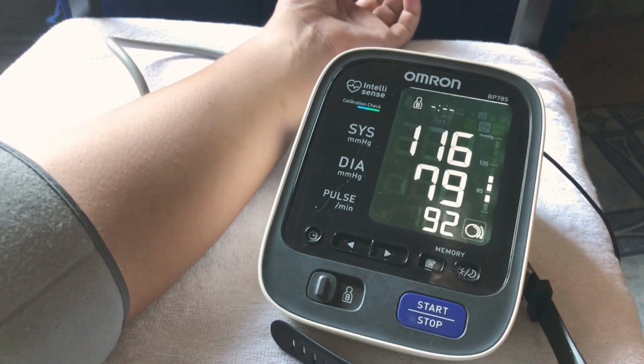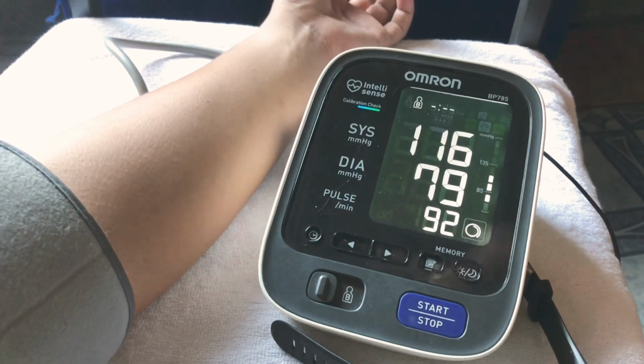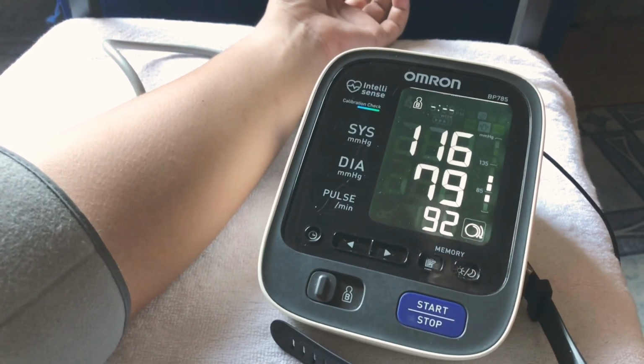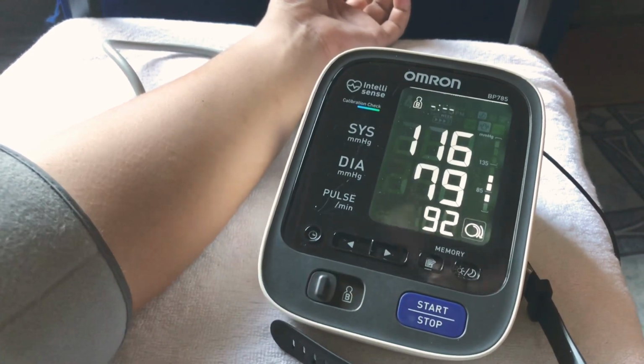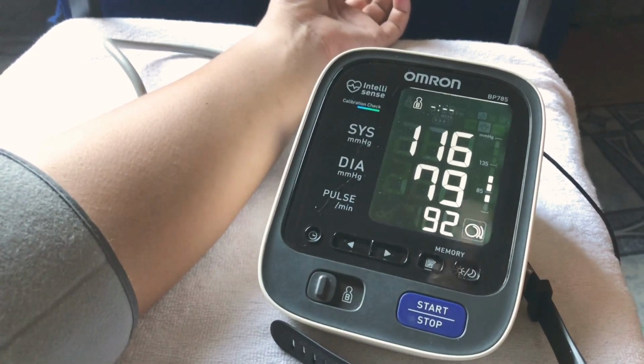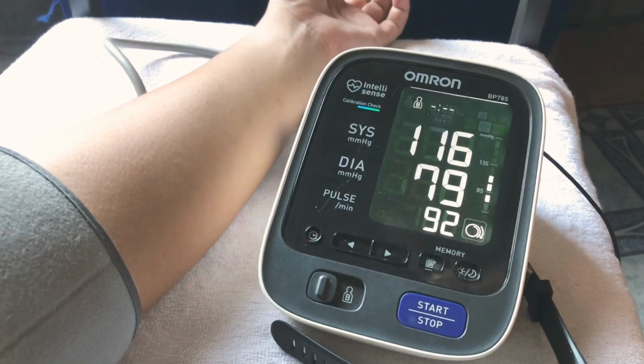Alright guys, so this is now the result of my blood pressure. It's 116/79. So I think that is very good, guys. Our heart rate is 92 beats per minute. So I think that's not bad.